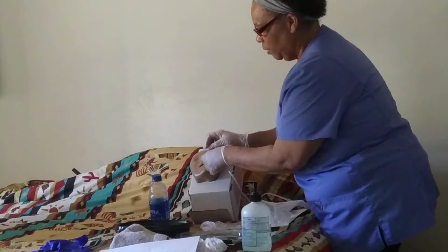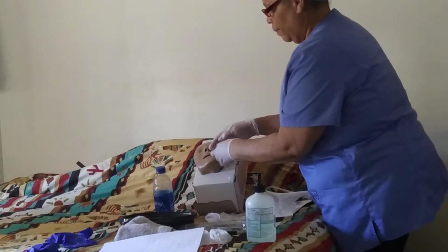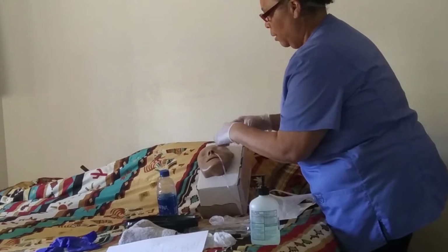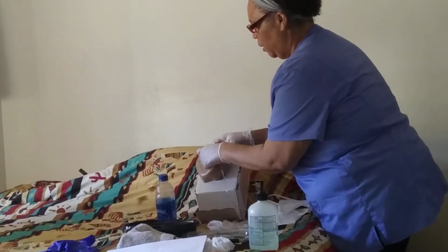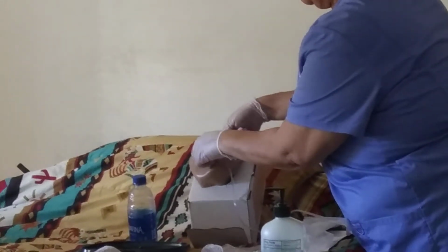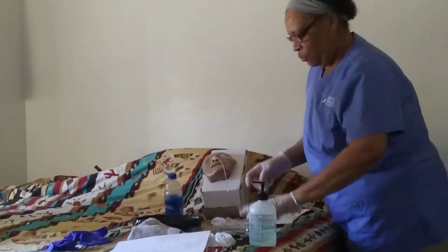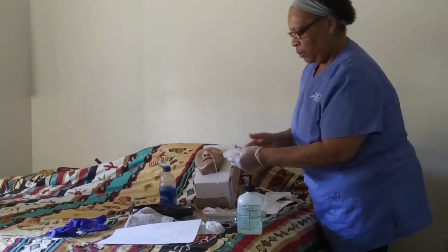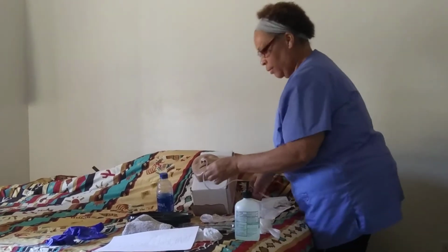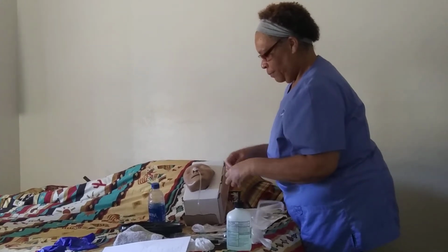So I have the temporary piece of tape. I'd be having assistance. I place the tape over here just to hold it in place temporarily. At this point, I can remove my gloves. And then to better anchor the tape down, I do another piece of tape, about 10 inches.